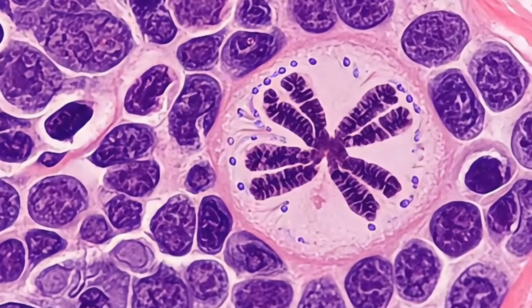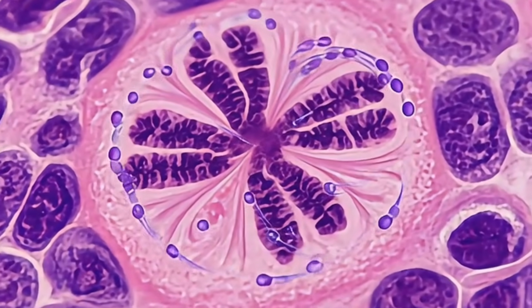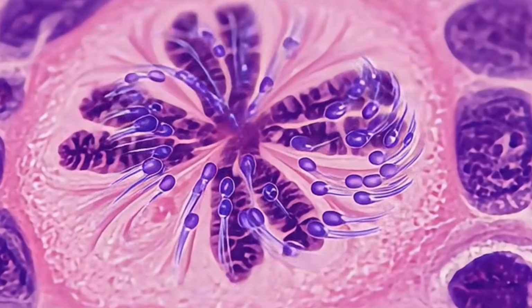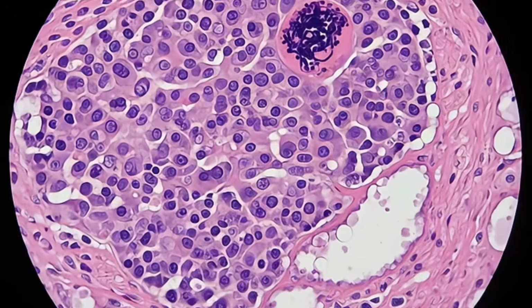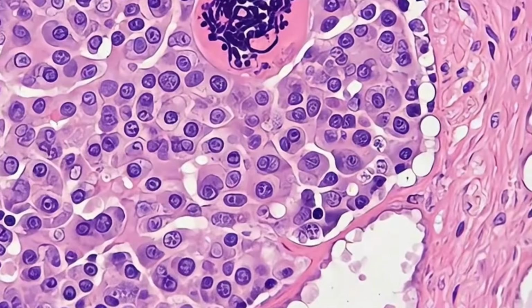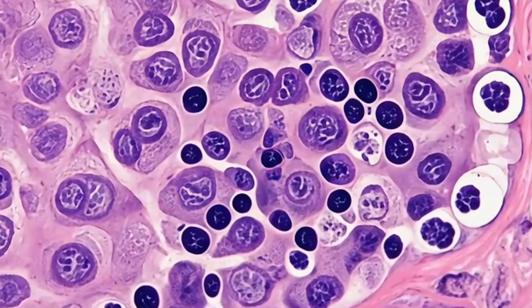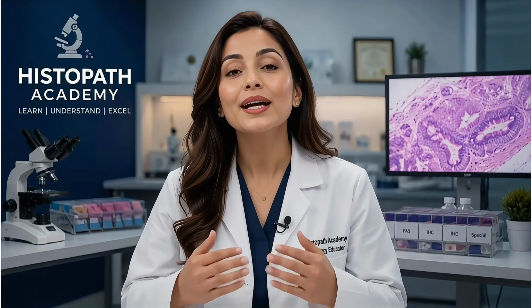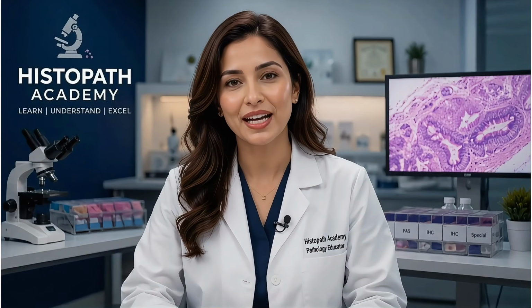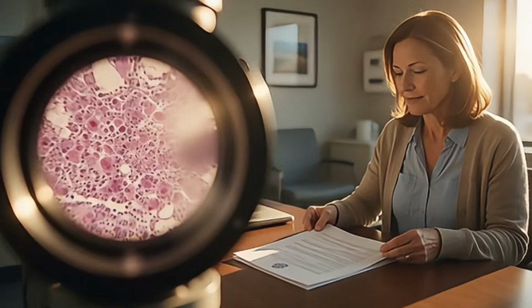When a pathologist sees these abnormal cellular features together with the invasive growth pattern we saw earlier, the diagnosis becomes clear. These are malignant epithelial cells that began in the breast ducts and have invaded the surrounding breast tissue. That is why the final diagnosis is invasive ductal carcinoma. Now, those 4 frightening words on the pathology report tell a completely different story. They are no longer just medical terms. They are a precise description of what the pathologist actually saw under the microscope.